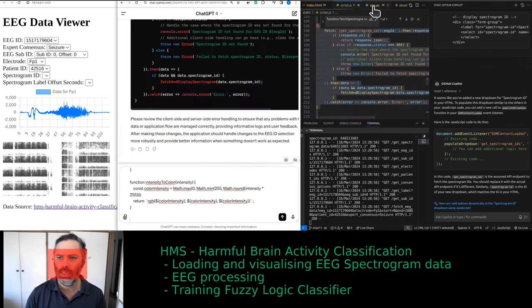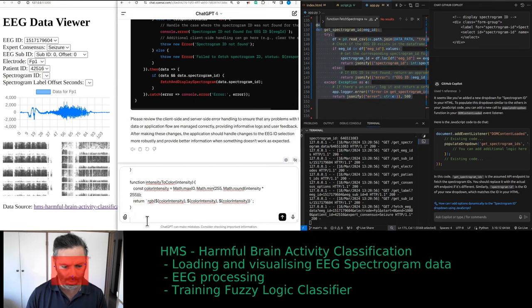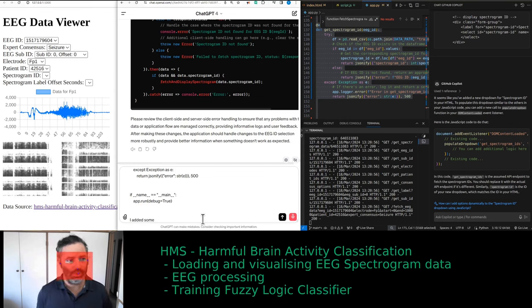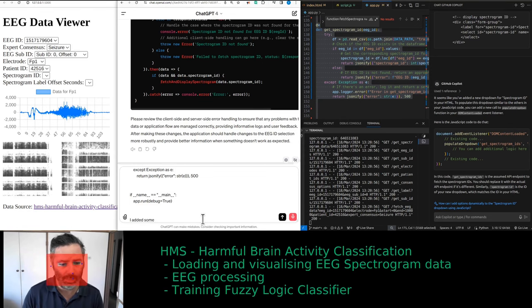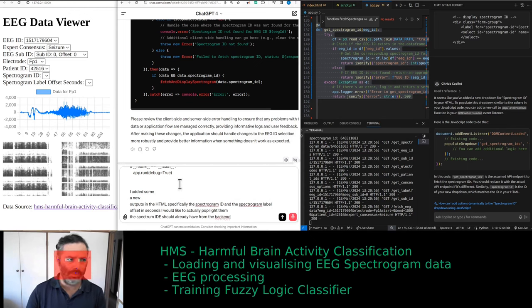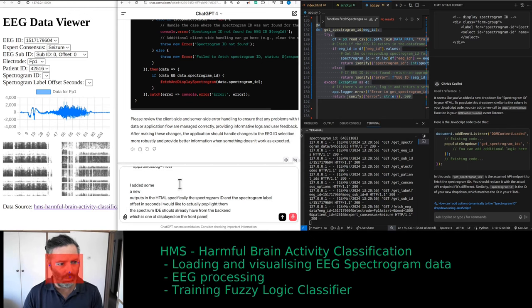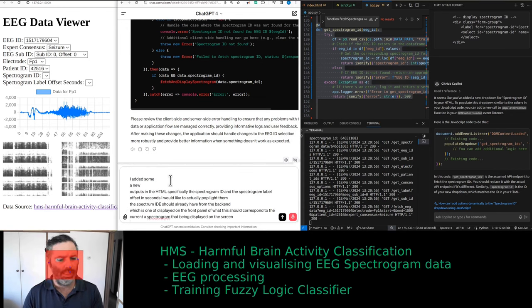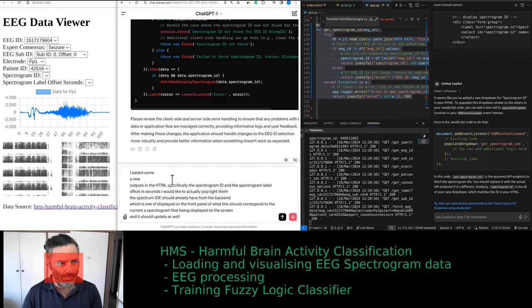We need some explanation for this HTML page before we publish the tool. The code is medium-sized. I added some new outputs in the HTML — specifically the spectrogram ID and the spectrogram label offset in seconds. I would like to populate those. The spectrogram ID we should already have from the backend — we just want to display it on the front panel, corresponding to the current spectrogram, and it should update when a different EEG ID is selected.